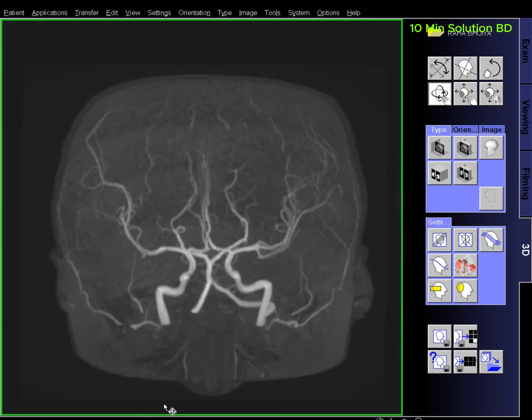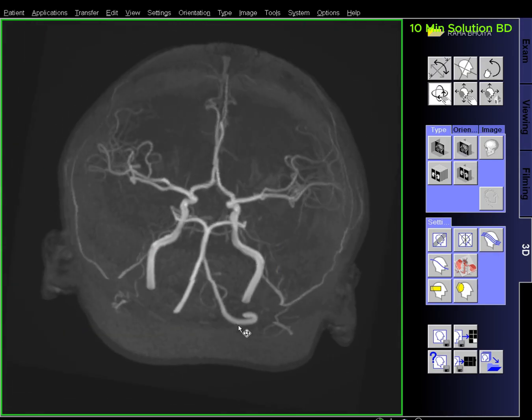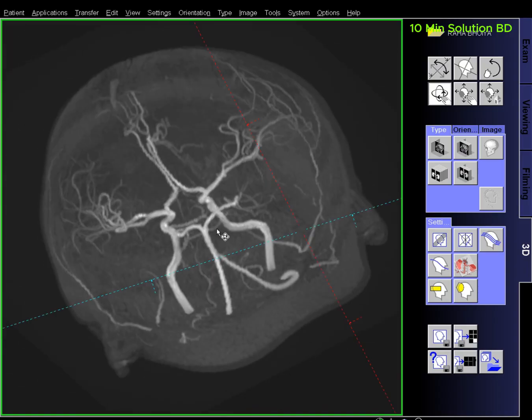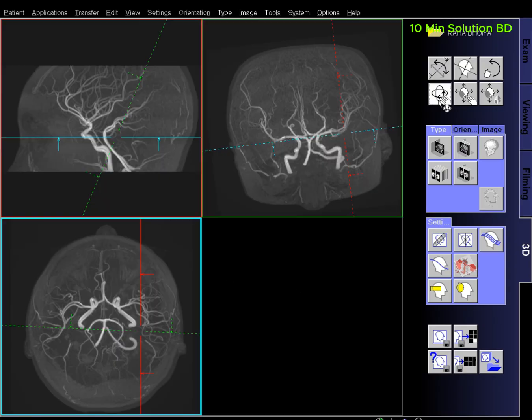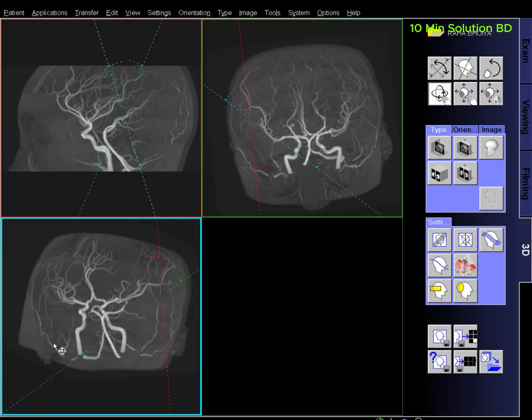Contraindications for MRA brain: any electrically, magnetically, or mechanically activated implant, for example, cardiac pacemaker, insulin pump, biostimulator, neurostimulator, cochlear implant, and hearing aids. Intracranial aneurysm clips unless made of titanium.